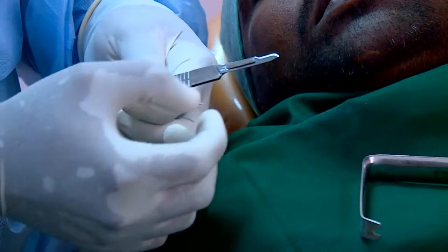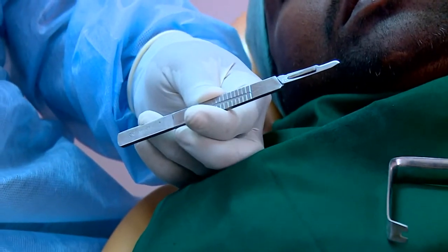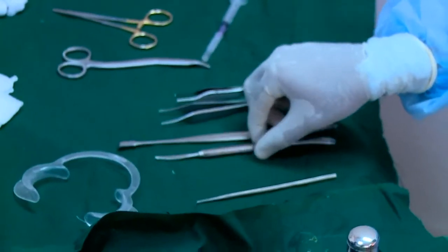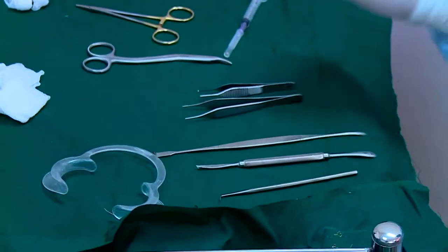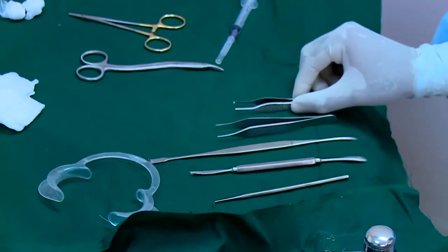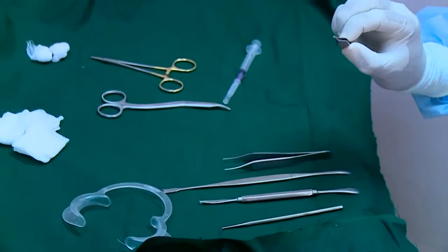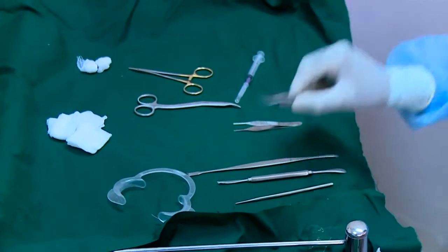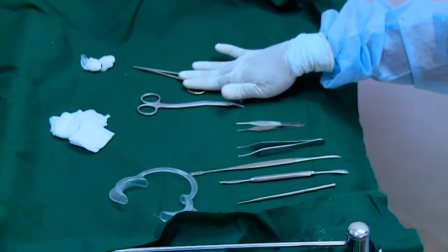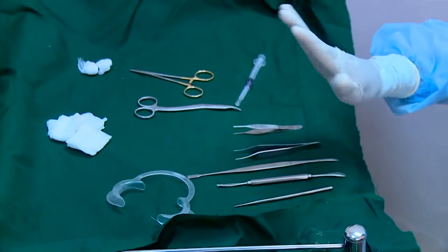A number 3 handle with a 15 blade, and my armamentarium here is fairly simple. We have a periosteal elevator, Harvard's periosteal elevator. We have a couple of forceps, tissue forceps. One has a tooth at the end, you can see, and the other is non-toothed. Suture needle, a needle holder, and scissors. That's our armamentarium, plain and simple.